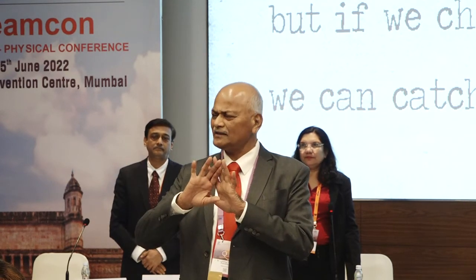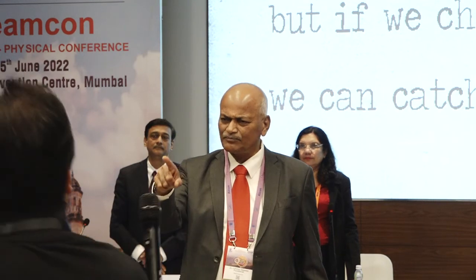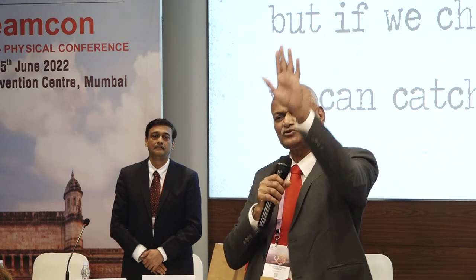So in such a situation, don't do any other thing. Go for the temporal SICS, and you will be happy. And do SICS like the superior only. Think that it is a superior portion. Just change your direction of mind, do it temporally, you will be successful.